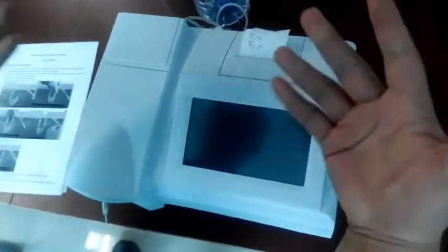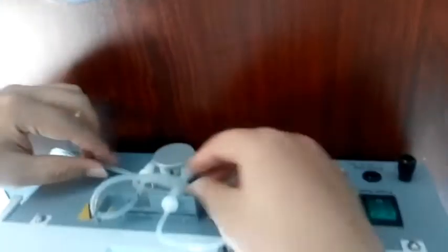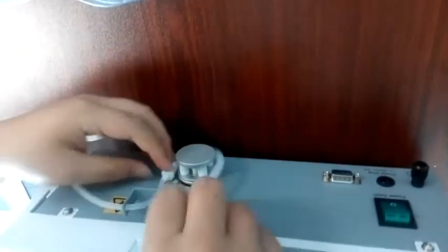Now let me use the user guide to show you how to install and test the machine. Firstly, you will see the pump is rolling like this. We should assemble the pump like this one. Because this tube is for the waste liquid, we should put it in the waste liquid bottle.